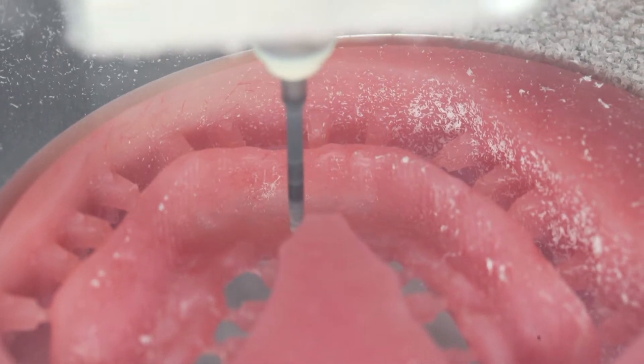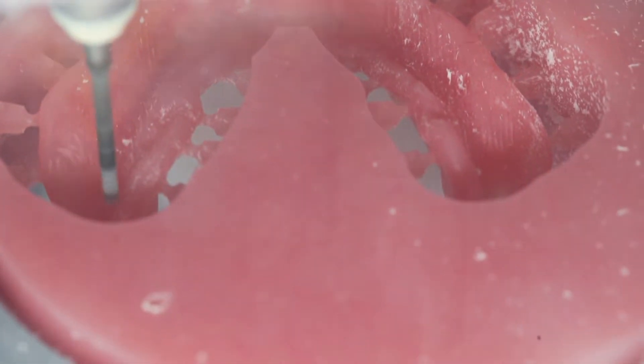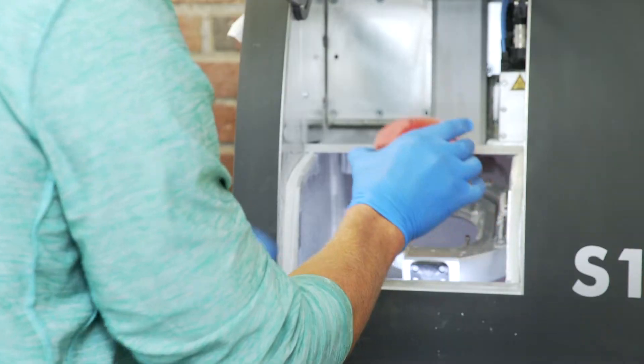When finished, a perfect denture frame is ready for polishing, tooth placement and finishing touches.